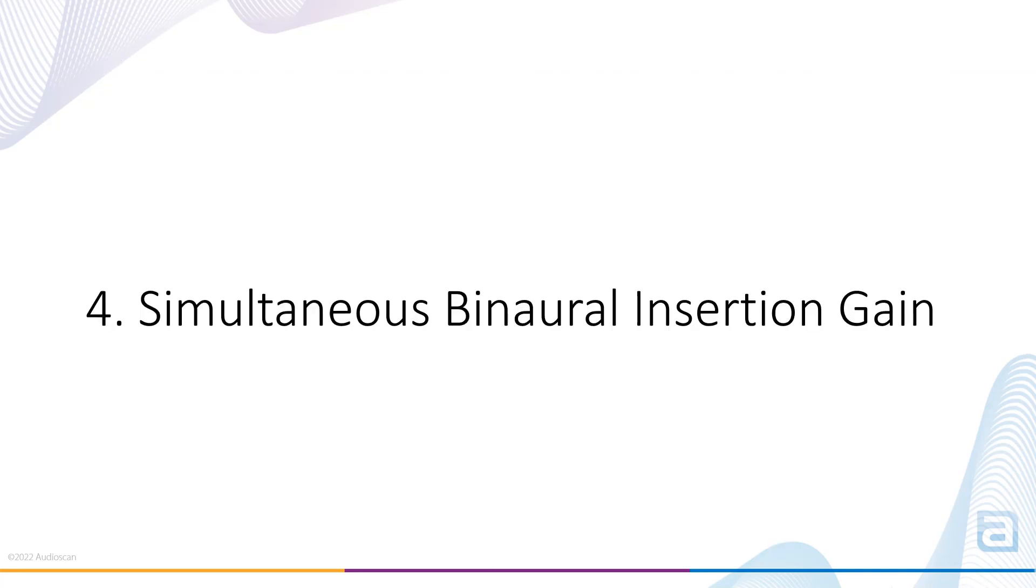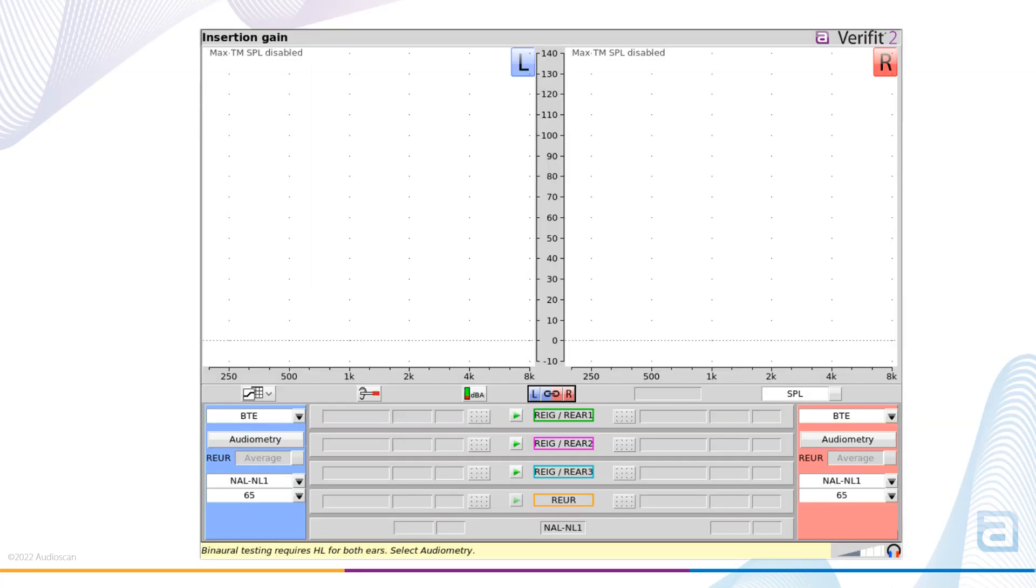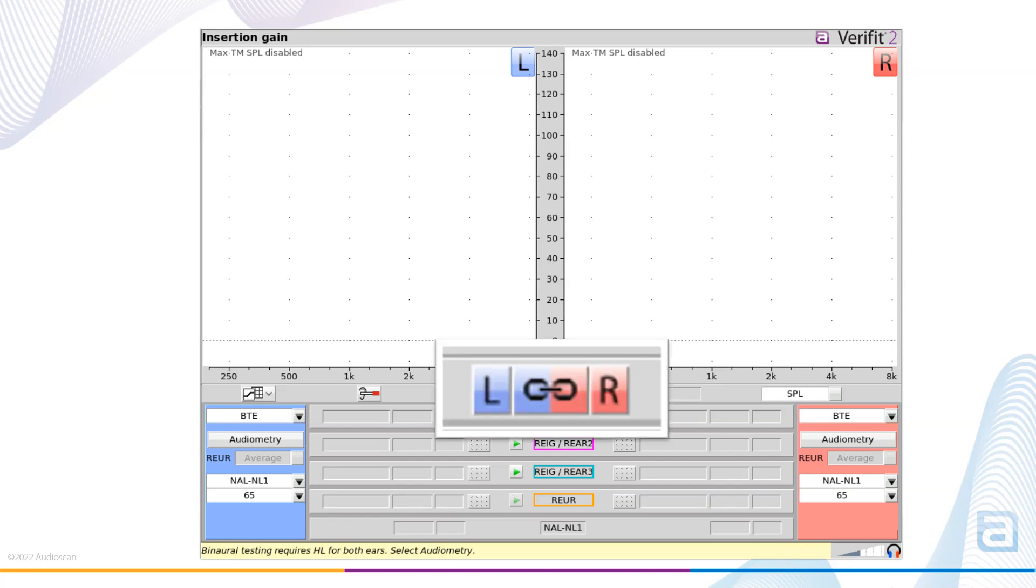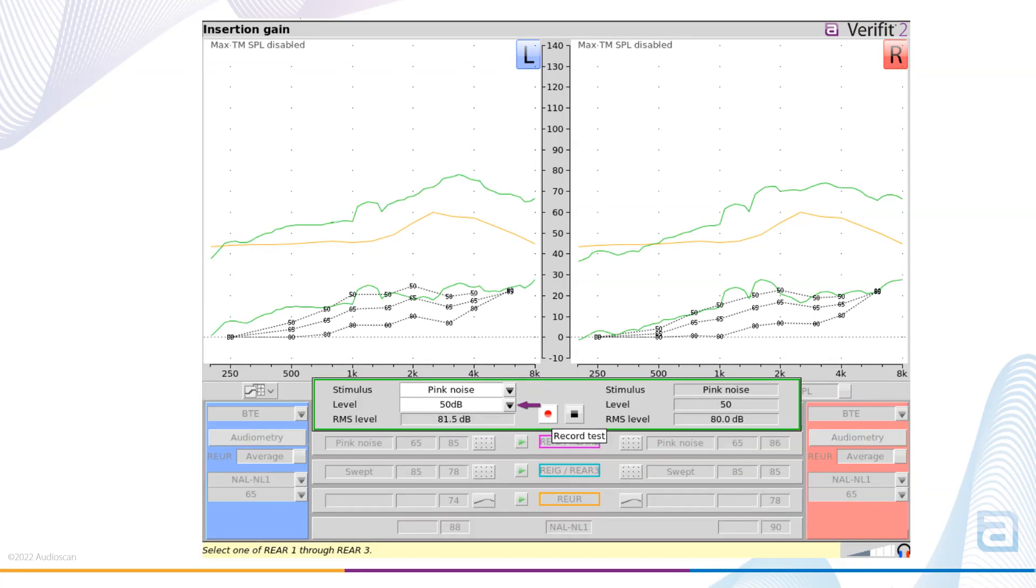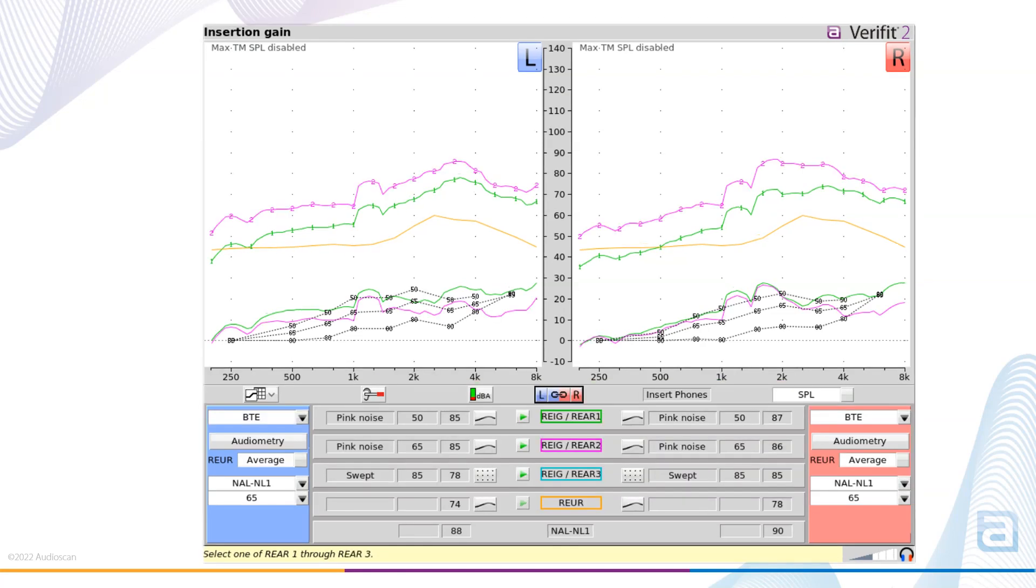Simultaneous Binaural Insertion Gain. Insertion Gain can now be run in simultaneous binaural mode, making measurements in the insertion gain test more efficient. With the binaural link for left-right set to measure both ears, select Play to start the stimulus measurement for both ears. Select the desired stimulus and level for the measurement, and then select Record to capture both ears at the same time. The test will run simultaneously for both the left and right ears using the selected stimulus and input level.